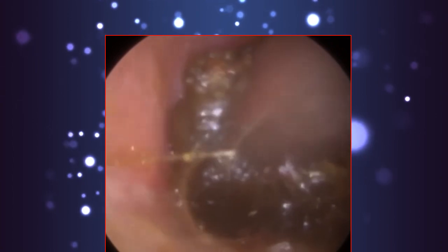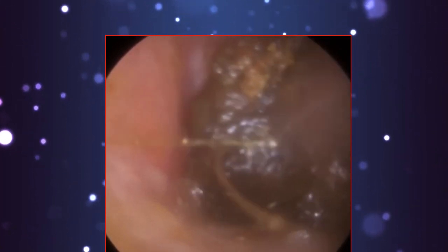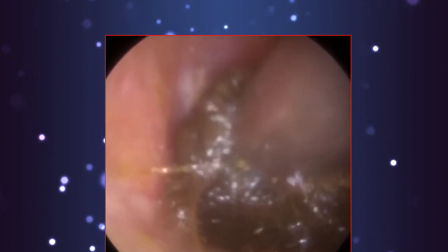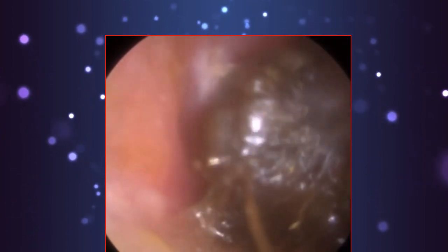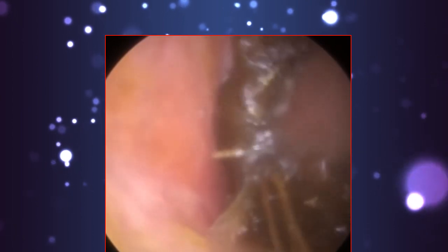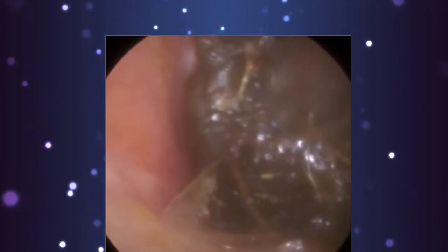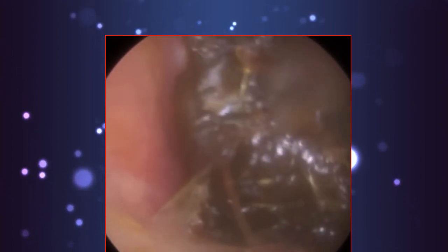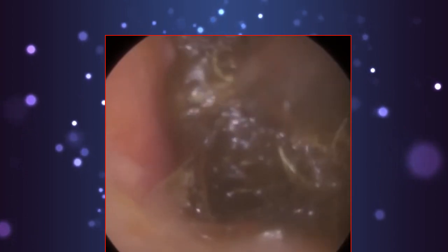So the idea here is when you've got this isthmus, this narrowing, when it protrudes back outwards, it creates two recesses, one inferiorly, so to the base of the eardrum, so it's almost like a trench, and one to the left in the case of the left ear, that's the anterior recess. And quite often when this wax plug is impacted, it gets trapped both in the anterior recess and also the inferior recess. So what I'm trying to do here is lift this plug of wax upwards out of the trench almost.